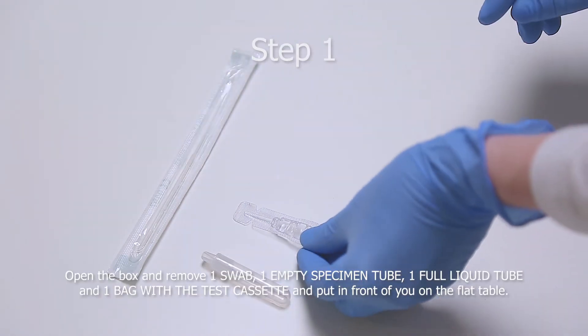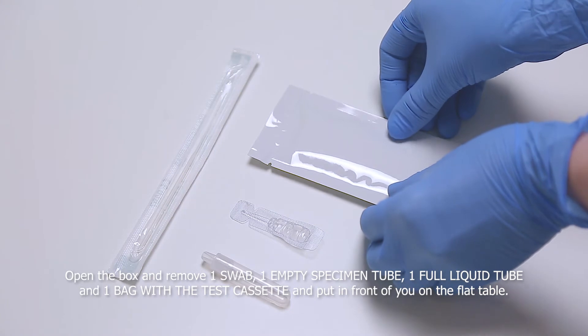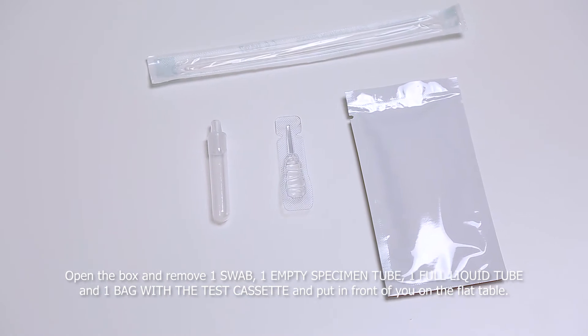Step 1. Open the box and remove one swab, one empty specimen tube, one full liquid tube, and one bag with a test cassette and put in front of you on the flat table.